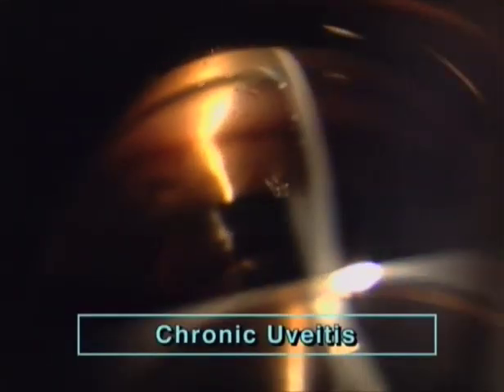Retroendothelial changes. Retroendothelial changes are signs of anterior chamber pathology. In this case of chronic uveitis, with a gonioscopic mirror, we see large mutton fat precipitates here. Here we see them in retroillumination, and here in optical section.